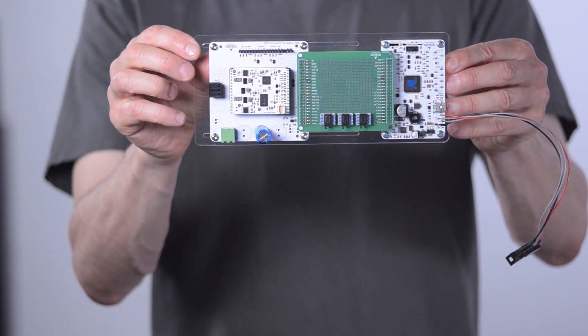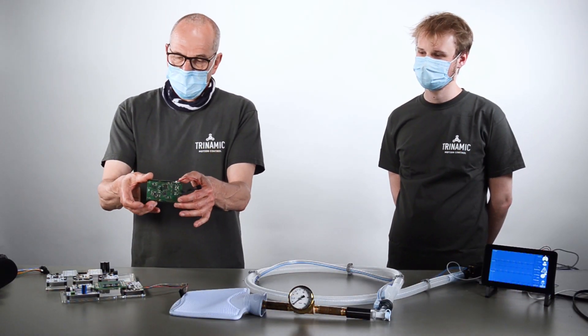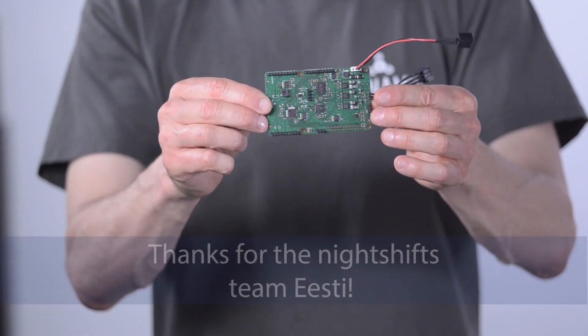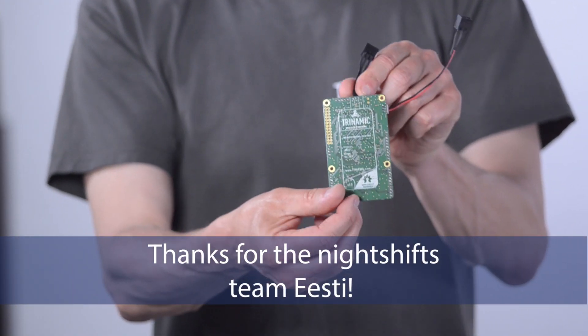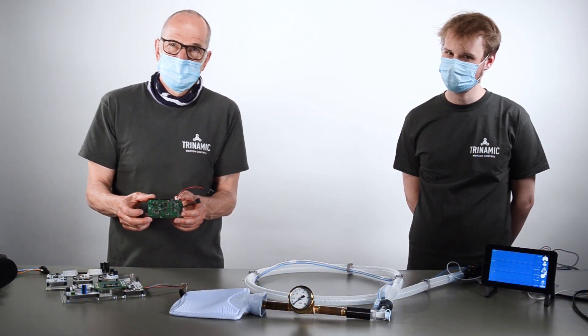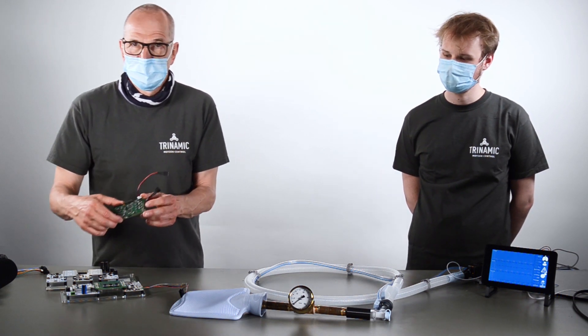We combined this board with our breakout board, and that was the base. But finally, in the end, we built this open source board, which was hardware-wise designed by our team in Estonia. You will find all the details — schematics, layout, and bill of materials — on GitHub.